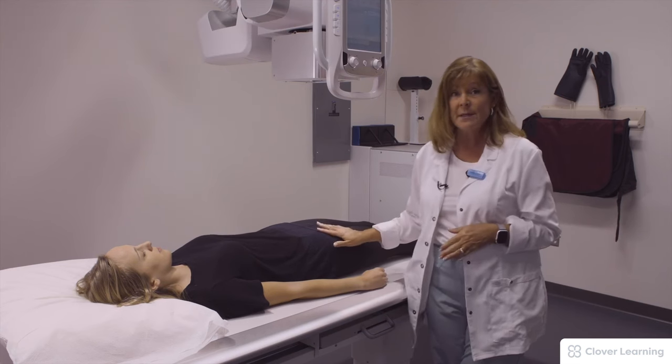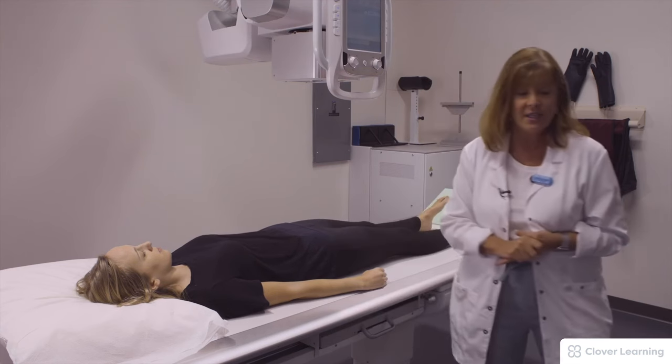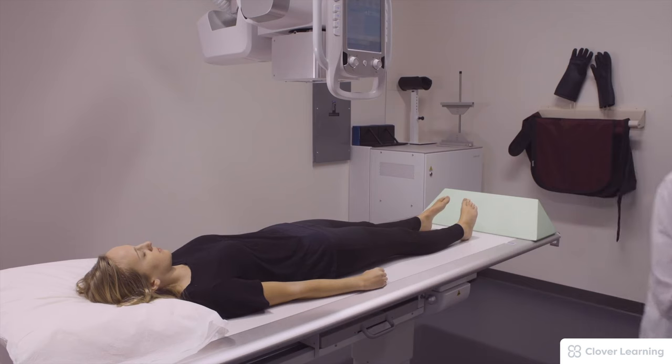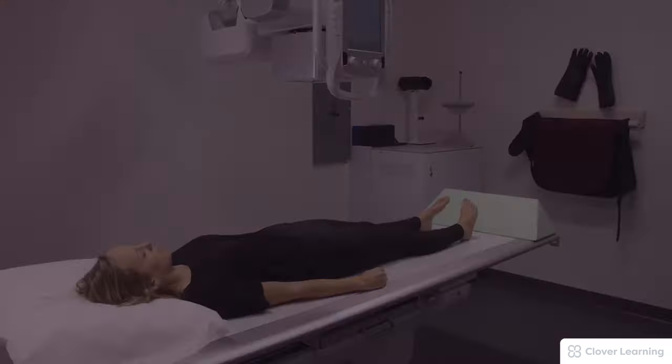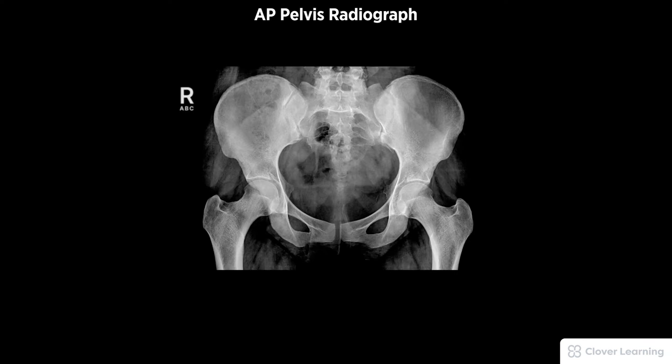She will suspend respiration and hold very still. A diagnostic AP pelvis radiograph must be free of motion and rotation. Demonstrated anatomy should include the entire pelvis and proximal femurs.